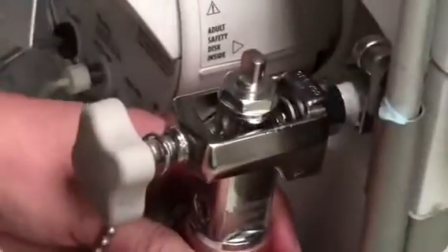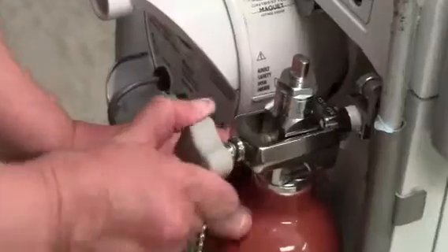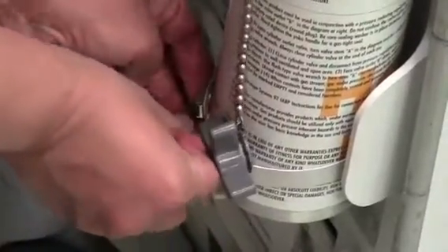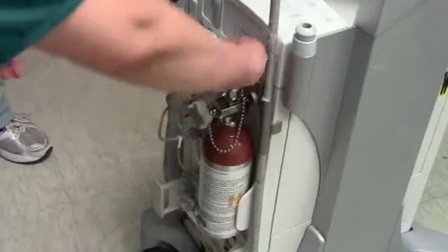Line up the male and female ends, tighten to the right, and close the latch so the tank holds in place. Now open up the tank by turning it to the left.